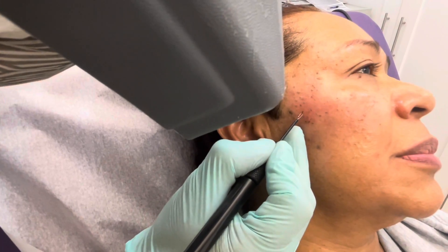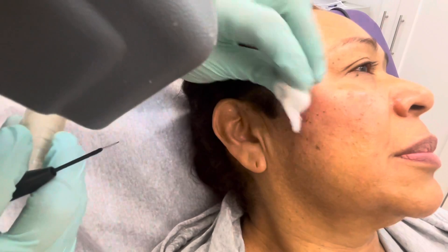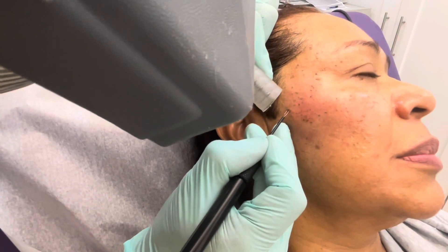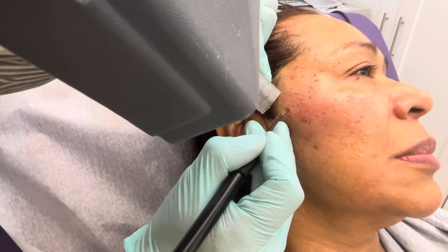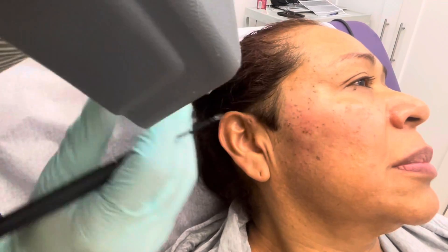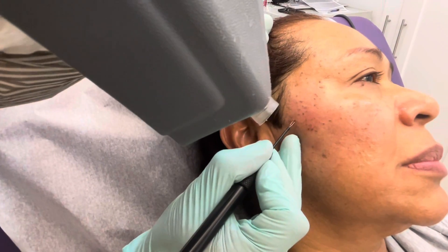This procedure is good for keratosis because keratosis is like a little benign skin lesion on the surface of the skin. It's not a freckle, it's not a sunspot. Those things we can take out with other technology, other lasers.